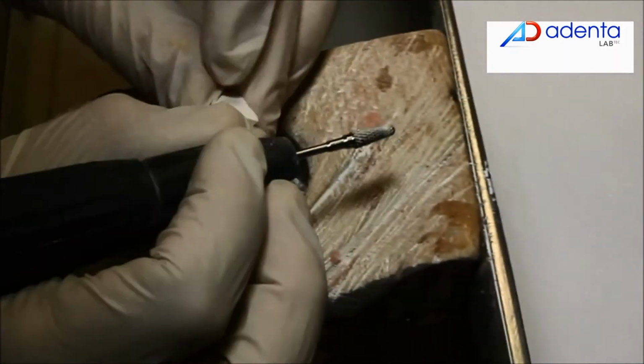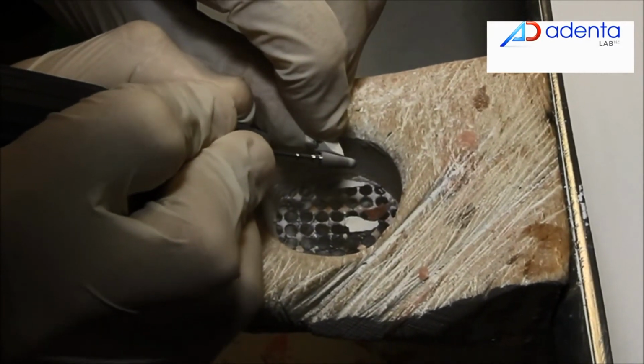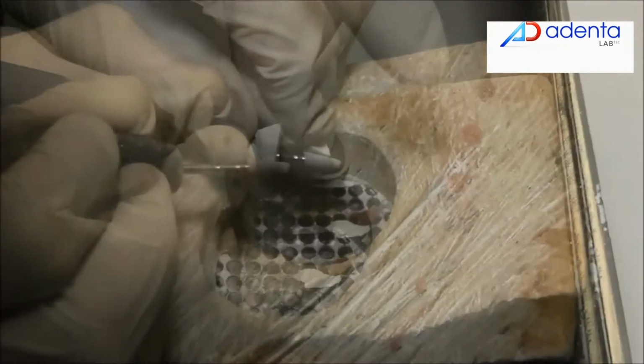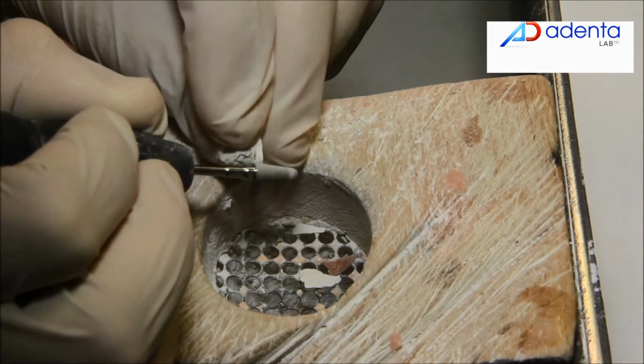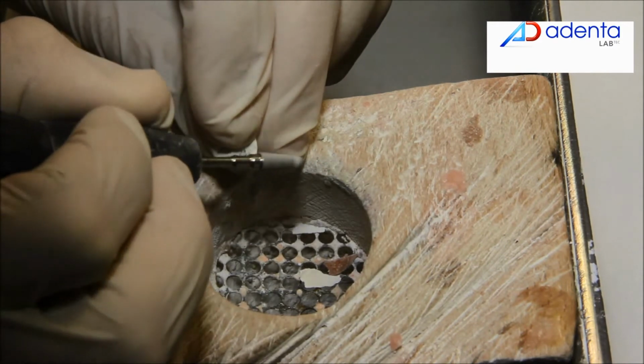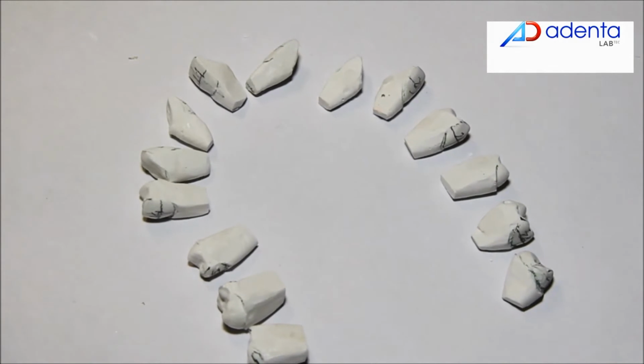When the teeth are cut and separated from each other, use the tungsten burr to trim the roots. A quadrangular shape will prevent them from rotating in the wax, but their shape should also allow you to make the necessary teeth movements.